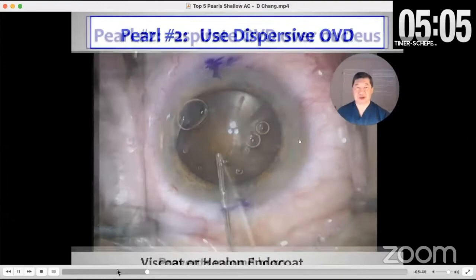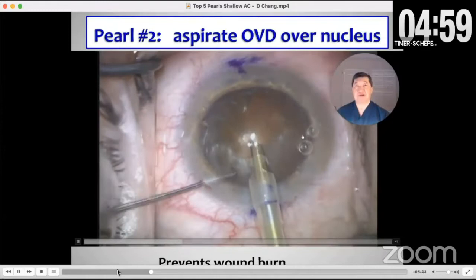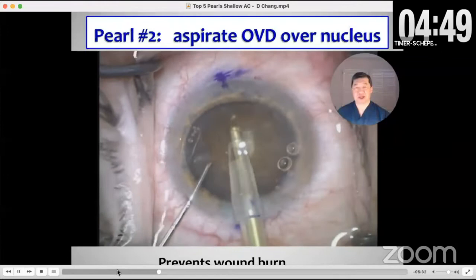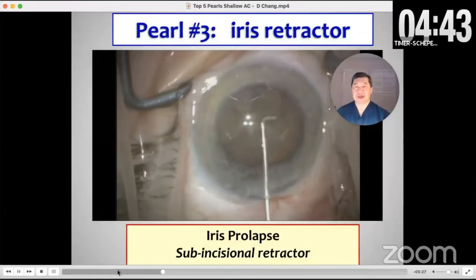Pearl number two is to always use a dispersive viscoelastic to protect the cornea. But remember that you have to aspirate it right above a brunescent nucleus. Otherwise, when you start sculpting, you can get a clogged phaco tip with this thick viscoelastic mixing with the brunescent nuclear material.